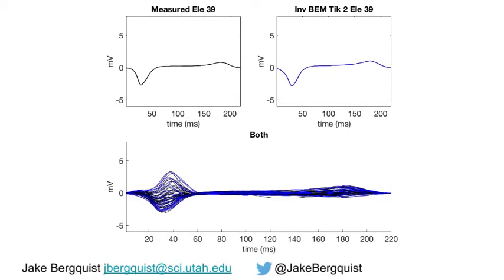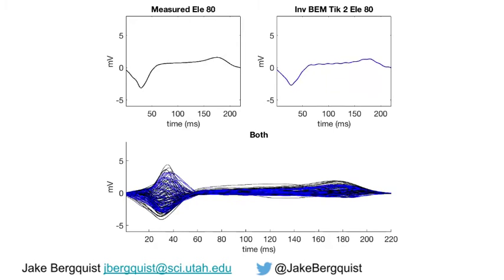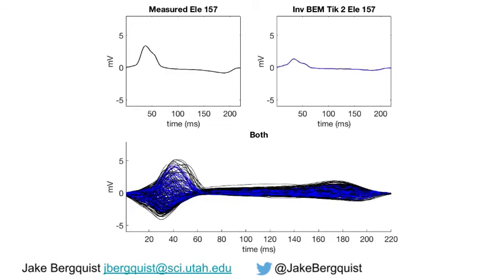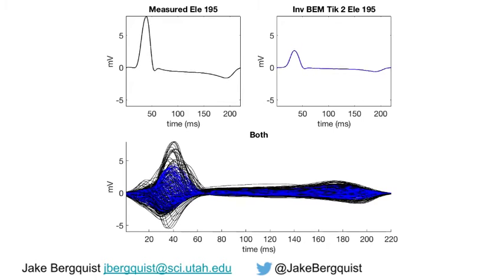We also notice high correlation not only in the QRS region of the signal, but the T wave as well. This is notable as many inverse studies neglect the T wave. However, T wave morphology is important in certain disease contexts.